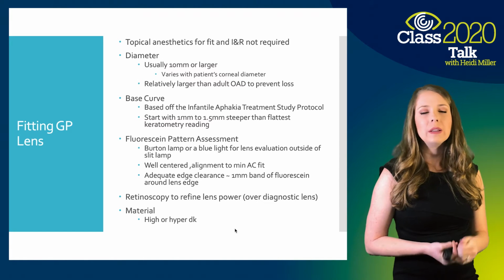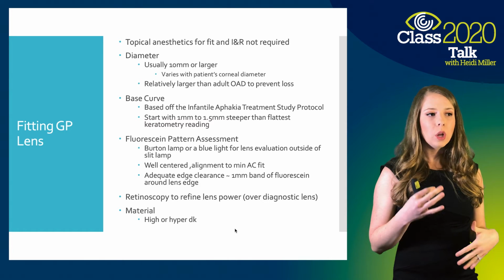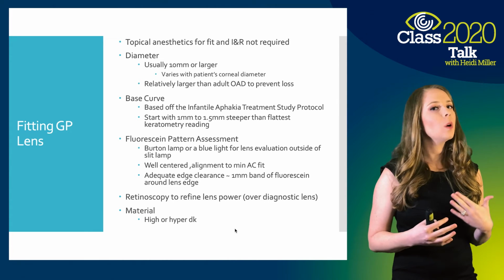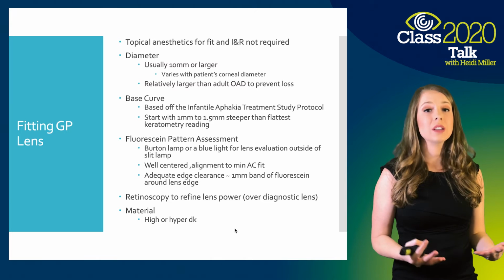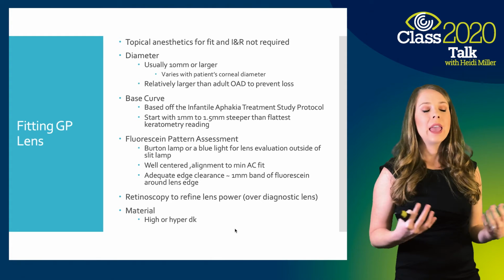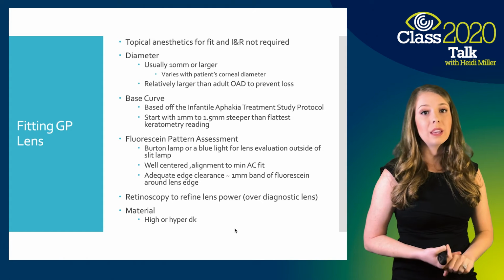So I feel like if I don't have enough time to have a cooperating patient, I don't want to spend any minutes putting a drop in that will start the fussiness, start the crying. So I try to skip that step. I don't think the lens awareness is really a big issue.